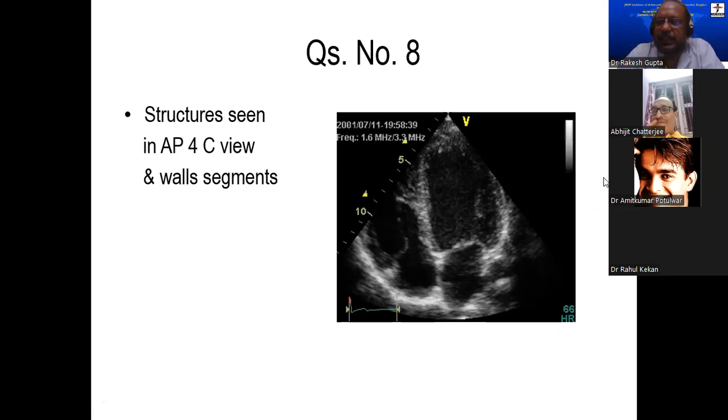Dr. Krishna Yadav, say it again now. How do you make 4-chamber view? Quick. We are not going to spend so much time with you, Dr. Yadav. Okay. Tell me how do you make 4-chamber view?